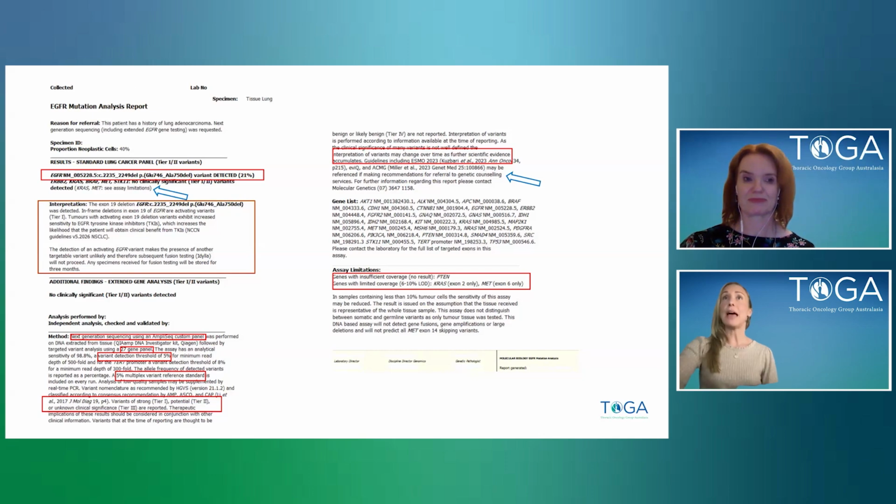Yeah, and here you need to have your tier, which as Stephen described earlier. You need to spell out what kind of variant you're dealing with, and the impact guidelines are quite specific on this. It needs to be in a way that is understandable to a clinician, and if there are any prognostic, diagnostic or therapeutic indications, they need to be spelled out as well.